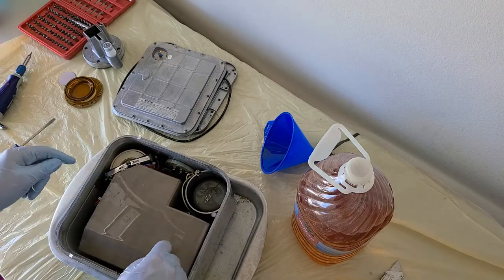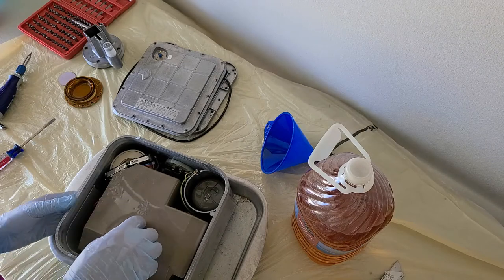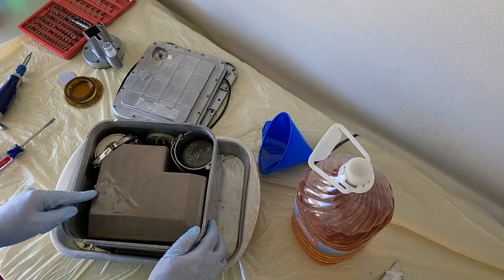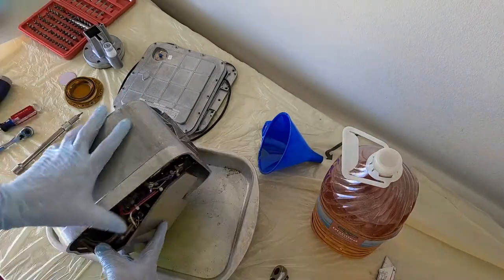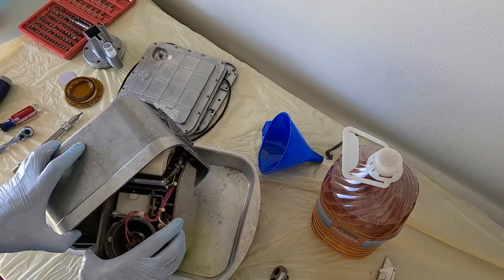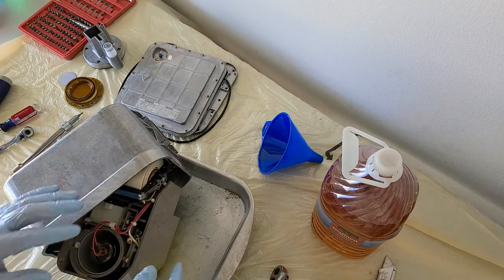I just got to figure out how to take this whole thing apart. Looks like we have a few screws inside holding on this giant plastic cover. So we're going to go ahead and take off this plastic cover next. All right, I see the tube already. All right, I just got to cut those wires.